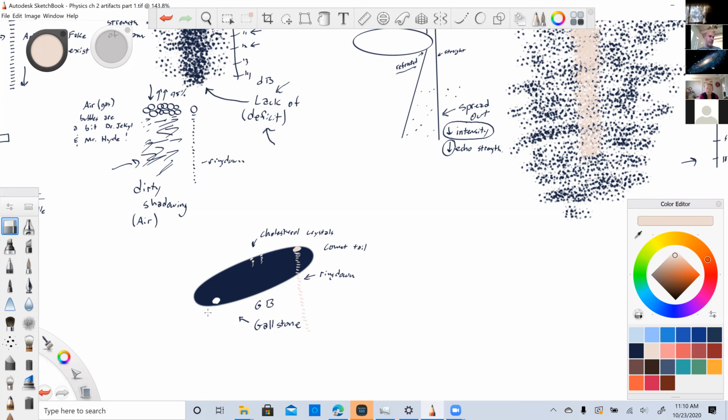And shadowing, enhancement, and we'll talk about the other stuff at another time. Too much attenuation, shadows. Shadowing is the result of too much attenuation, which is the true anatomy structure, reverberation. Yeah, okay, we're cool. You guys, any questions today?